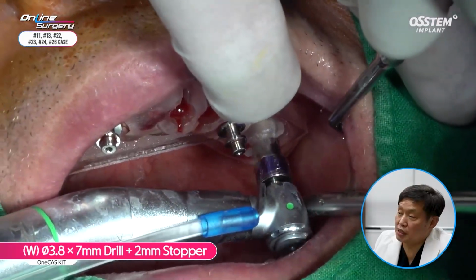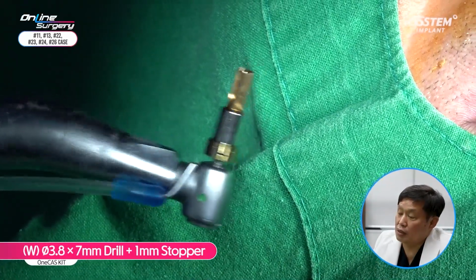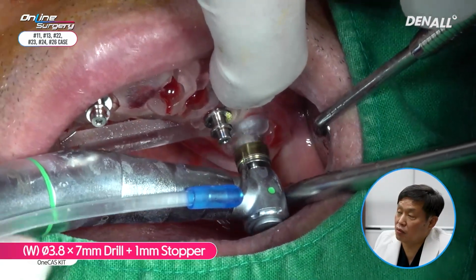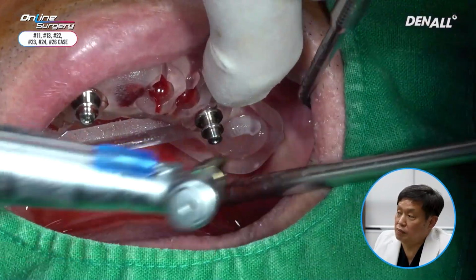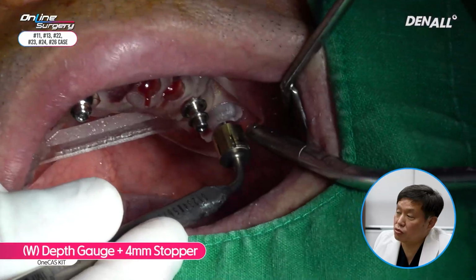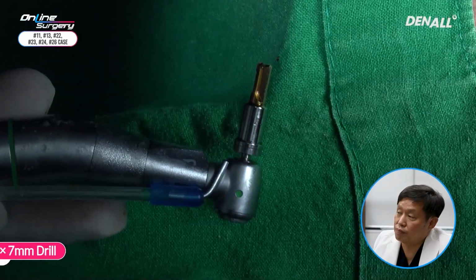5 millimeter drilling was done using a 2 millimeter stopper, followed by a 3.8 by 7 millimeter drill with a 1 millimeter stopper. So drilling was done up to 6 millimeters. Because 6 millimeter drilling was done, with the depth gauge, a 4 millimeter stopper was used to check whether sinus floor penetration was done. There is no proper contact, so the penetration was yet to be done.